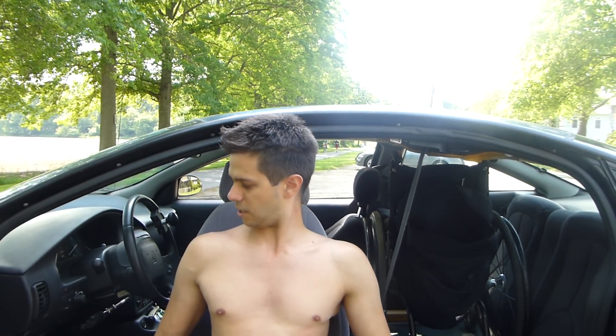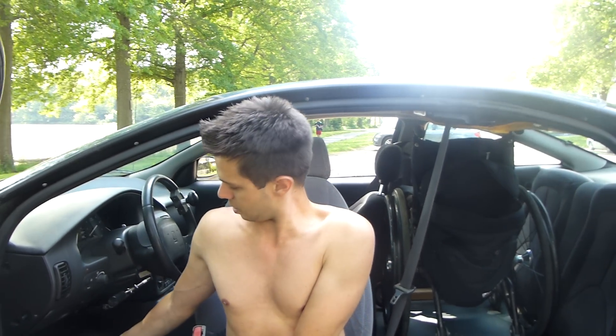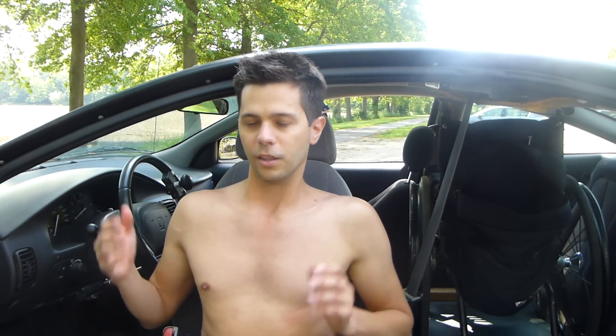One other thing I should mention is that even though the hand controls are in the car, someone else who is able-bodied can still use the regular foot pedals just like they would in any normal car. It's really useful. The adjustments cost around a thousand dollars, if I remember correctly, but if you get a new car, some dealerships will reimburse you that cost.